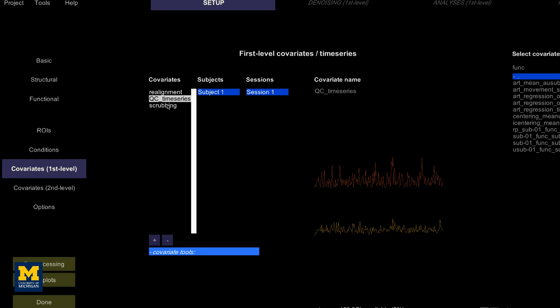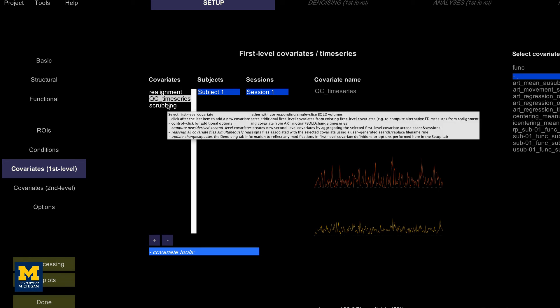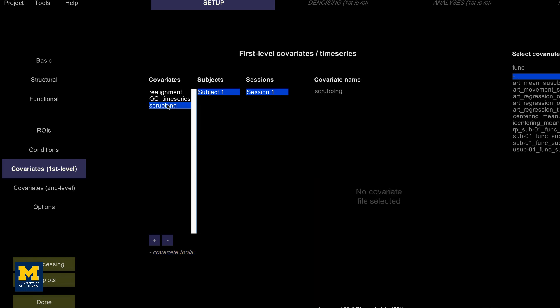The last covariate, scrubbing, will display any volumes that have been modeled out of the data or scrubbed. This subject was very still during scanning, so no volumes have been removed. Later on, we will see subjects that have had volumes removed by scrubbing.